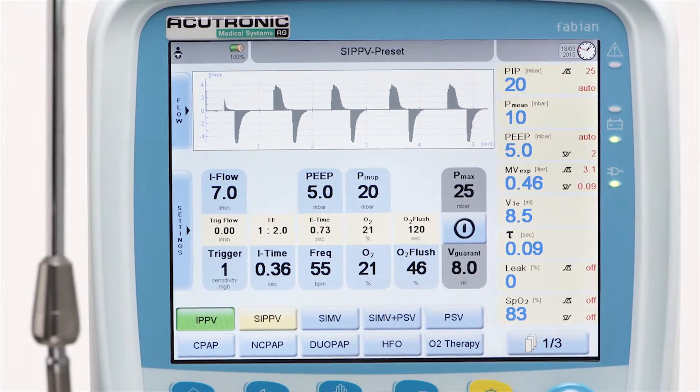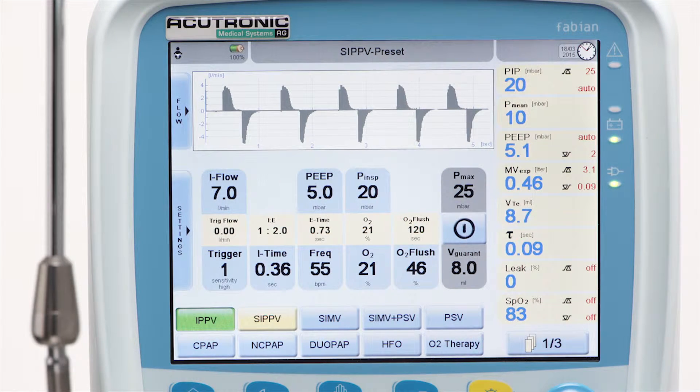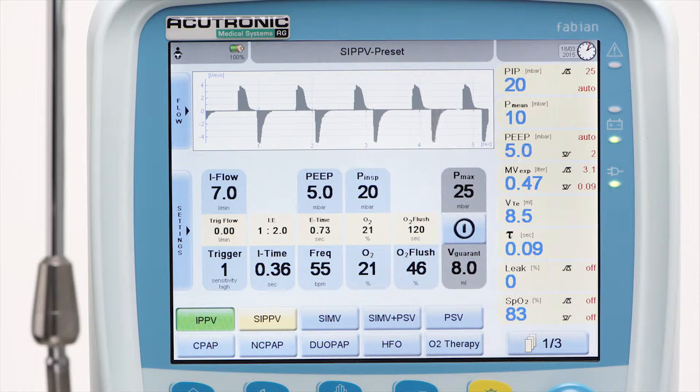SIPPV mode allows the patient to trigger or synchronize a time-cycled, pressure-limited breath. Each inspiratory effort of the patient reaching the preset trigger threshold level will initiate a synchronized supported breath. The amount of breaths per minute — the respiratory rate — is influenced by the patient.